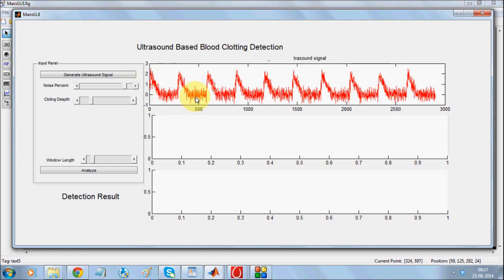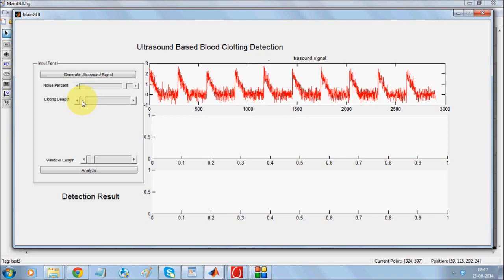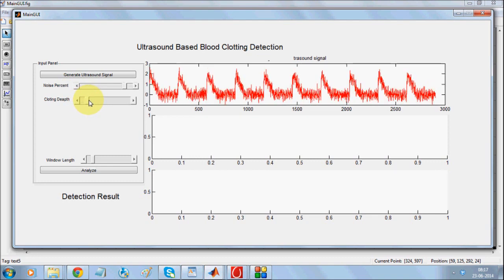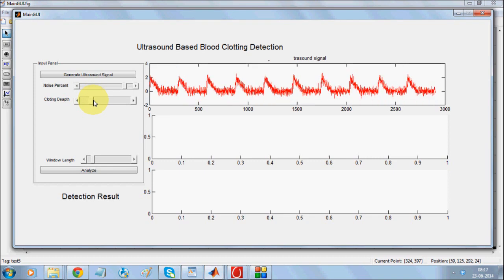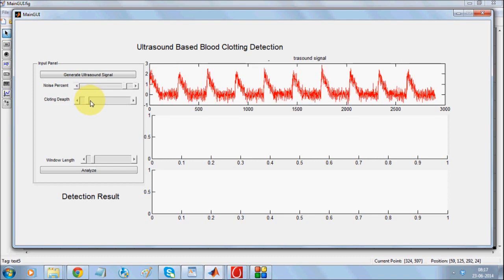If I increase it, as you can see, it is highly impossible for anybody to understand if there is a clotting or not. If I reduce the clotting, if there are any changes, it is significantly indeterminable by the naked eye. Now, I will be carrying out an analysis process.